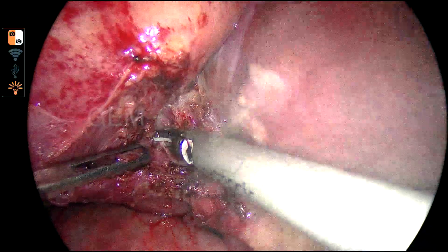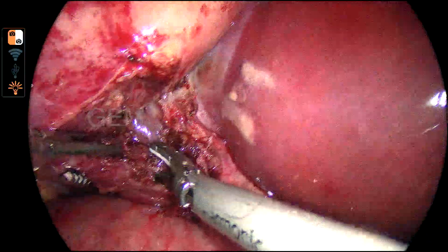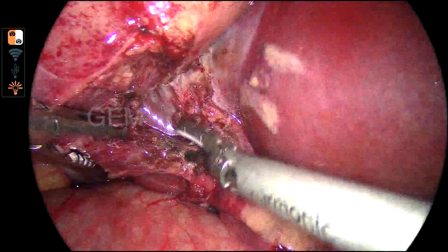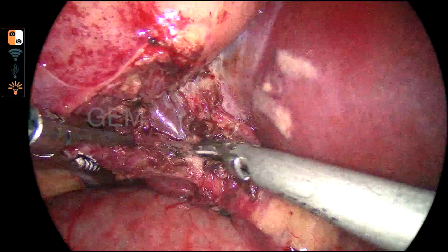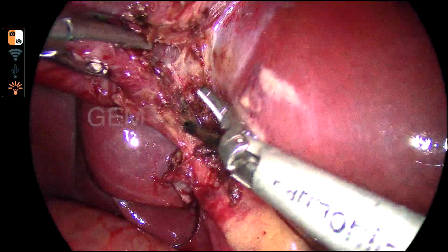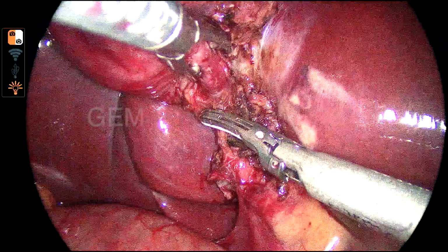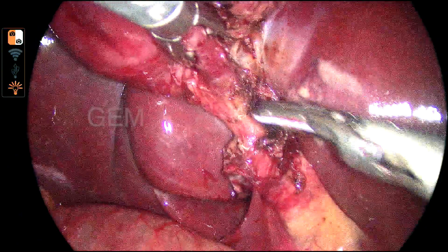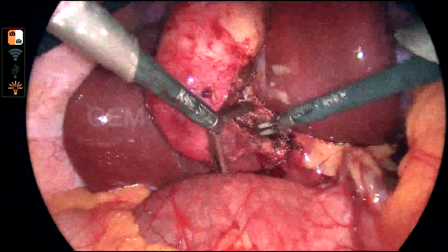So I am dividing all the small arteries coming to the cystic duct. So this is another anterior small artery. This is another artery. So here is another artery. You can see here, with the harmonic lower blade, I am skeletonizing the artery, and then I am dividing it. So these are all the small vessels covering the cystic duct. So it is cleared all around.